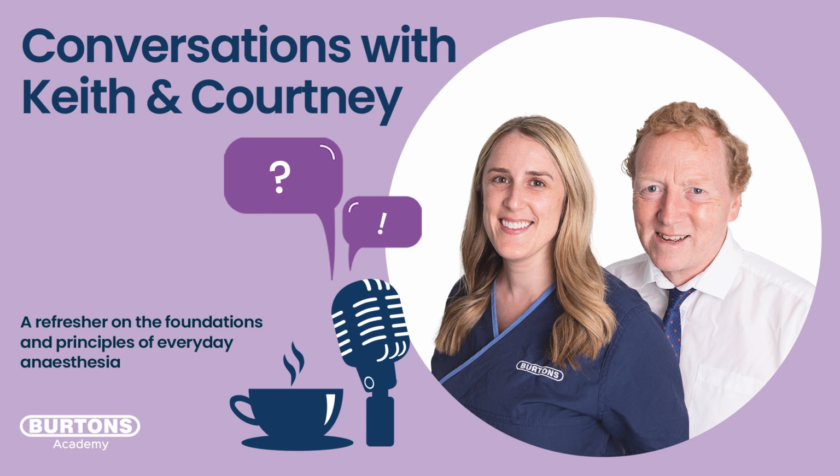So instead of delivering to a pressure, you've set your tidal volume to 155 mils for your 15 kilogram dog, and then it just delivers that volume. Oh, we've reached the 150, 160 that we set it to. Let's stop. So that's a clear way to think of describing it. And it does confuse people.